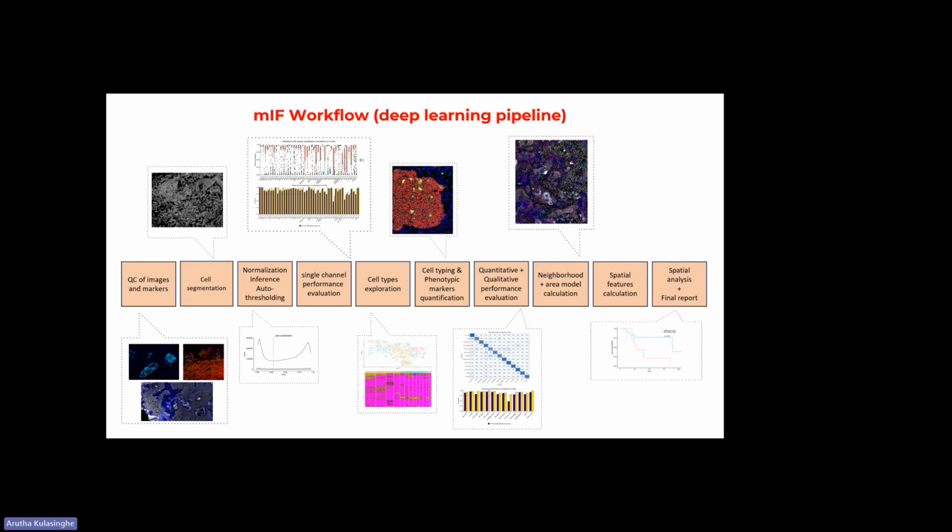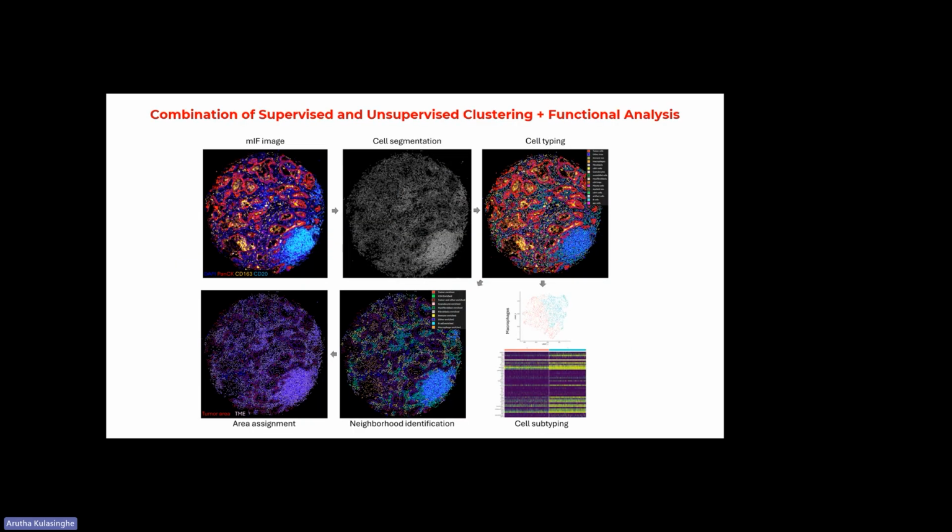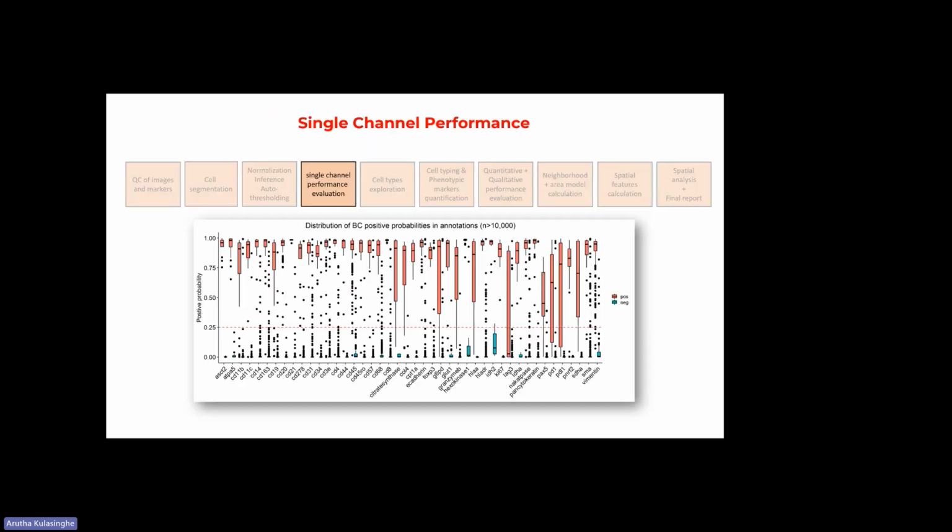And so what we then did, in collaboration with Nuclei from Israel, was we were able to benchmark our spatial multiplex IF data to pathology annotated H&E and spatial multiplex IF data. And so we have this sort of ground truth now that we can benchmark this pipeline of data to, and this is the computational pipeline for that. And so we can do our multiplex imaging, we can do our cell segmentation, the cell typing, the neighborhood analysis, and so on.